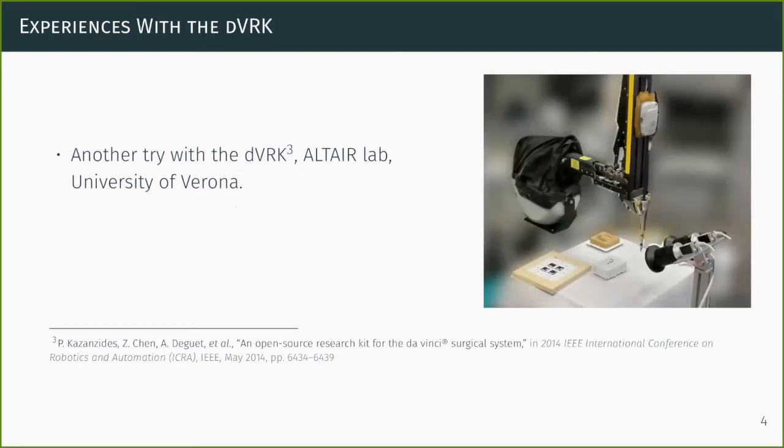Now, I had the chance to visit Paolo Fiorini's lab at University of Verona. Here I got to use the dVRK that they have there to further try automating this suturing task. This time I extracted surgical actions from a dataset similar to Jigsaws, but including camera calibration, a dataset recorded at University of Verona.